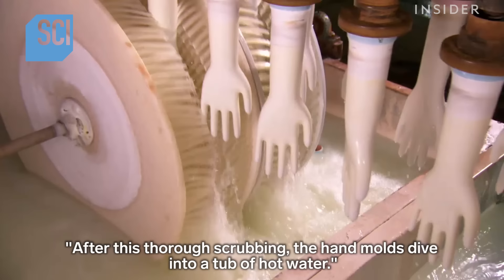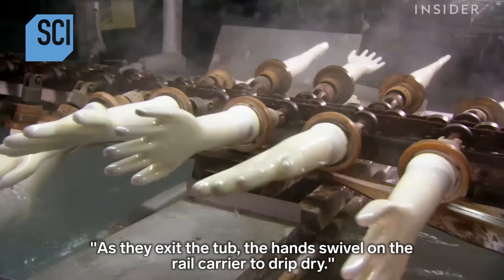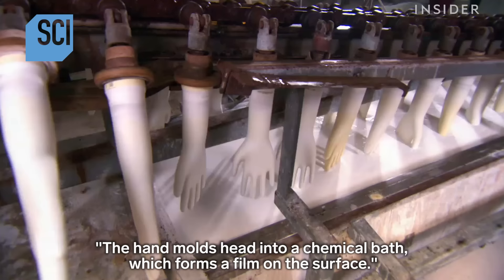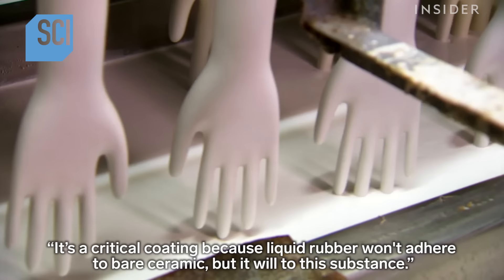The ceramic hands twirl into round revolving brushes whose bristles scour the surface and the hard-to-reach areas between the ceramic fingers. After this thorough scrubbing, the hand molds dive into a tub of hot water. As they exit the tub, the hands swivel on the rail carrier to drip dry.